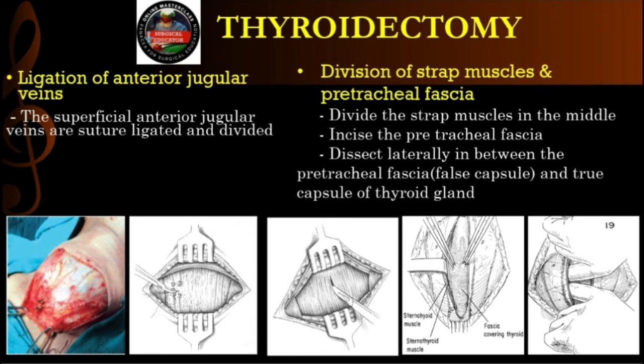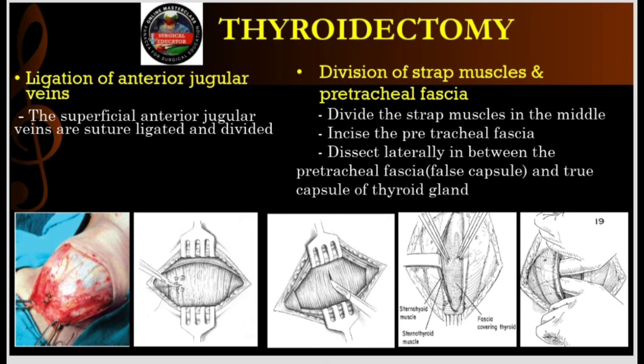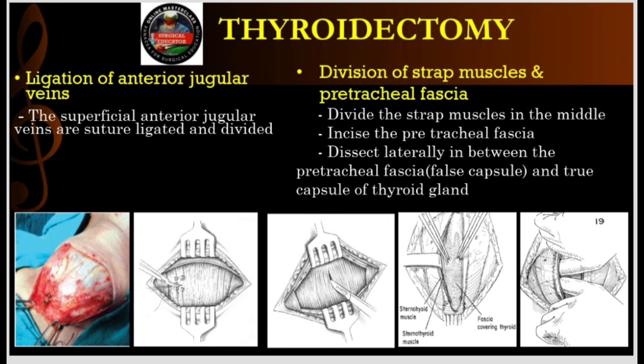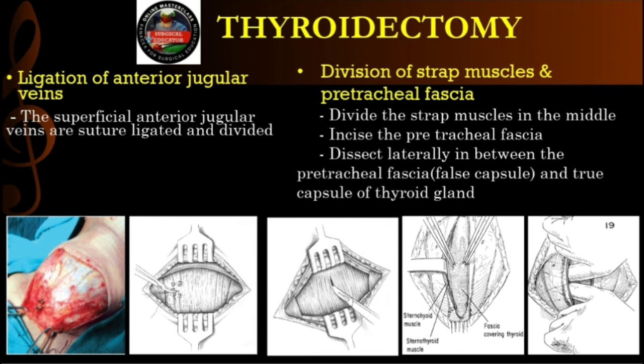Because the neck is a dynamic pressure system. Okay. If you just burn a large vein closed, it leaves a weak heat-sealed clot. When the patient wakes up from anesthesia and coughs, their venous pressure spikes massively. And that weak clot will just blow right open and you'll have a massive hemorrhage under the closed skin. You must physically pass a suture around it, tie a knot, and cut it. Permanent security. Secure the path.